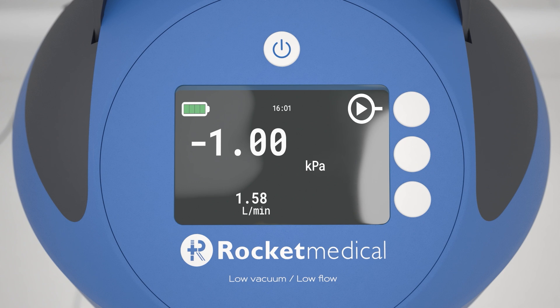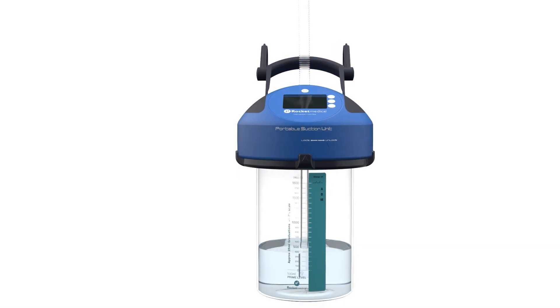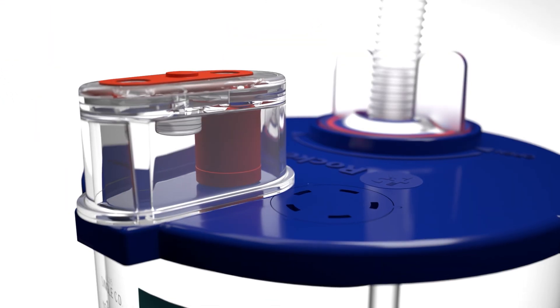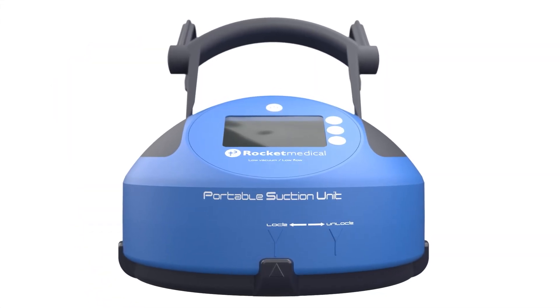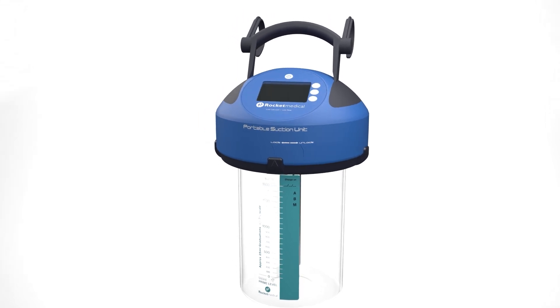When the air leak is resolved and the PSU is no longer required, turn off the device by pressing and holding the on-off button for longer than 2 seconds. Confirm that you wish to shut down the device and press button 2 to shut down the PSU. To remove the PSU from the chest drain bottle, apply a slight downward pressure, rotating the locking ring clockwise until the PSU is unlocked, then lift the PSU away. Remove the filter and dispose of it according to local guidelines. Clean the PSU following local guidelines. The device is now ready for the next patient. The Rocket Medical PSU — delivering portable suction to enhance patient care.